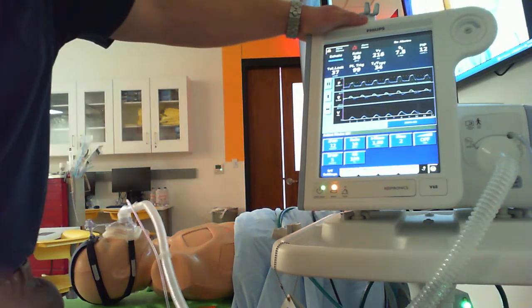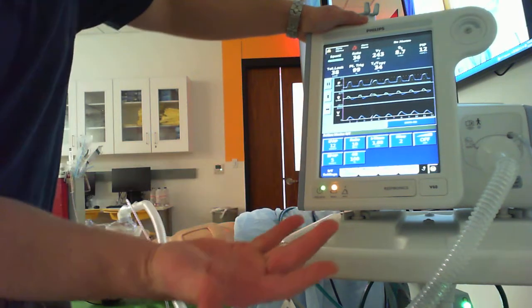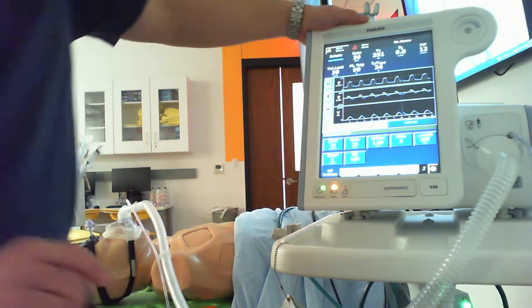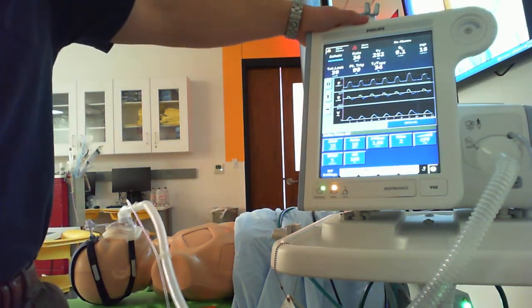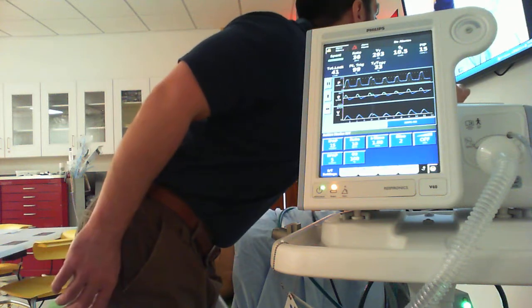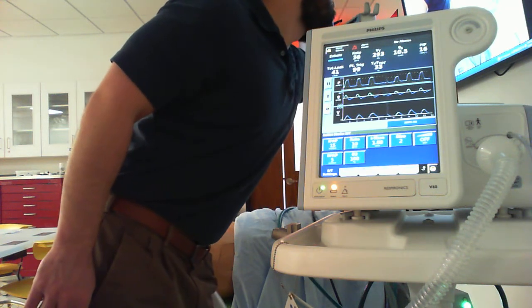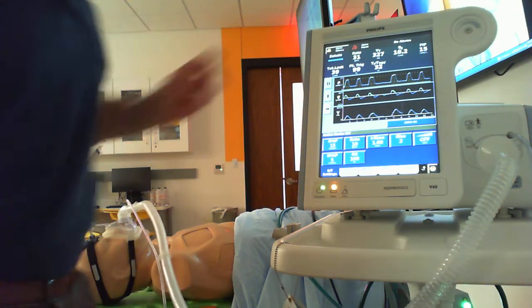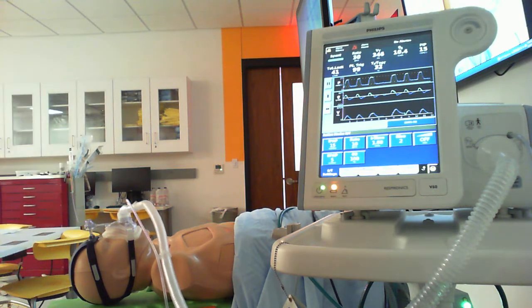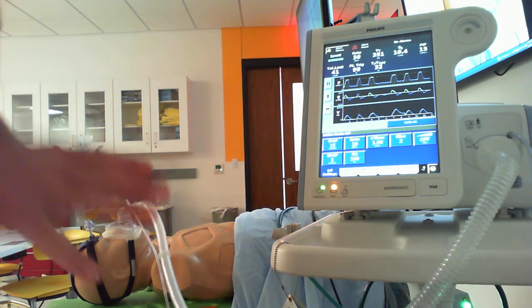And I'm going to give it a few seconds, and I'm going to watch my tidal volume here, okay? So it went up a little bit, and with clinical experience, you'll be a little bit more comfortable on how quick to jump. Okay, I'm going to go up to 15. So now I'm giving 10 of pressure support. I've increased my pressure support twofold here. You can see my tidal volumes are starting to improve. I'm going to make a couple of adjustments on my lung model here at the ASL. As this patient's tidal volume begins to improve, you should see their work of breathing improving. You should be seeing their spontaneous rate hopefully dropping down.